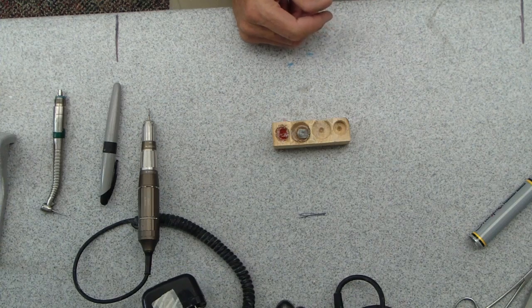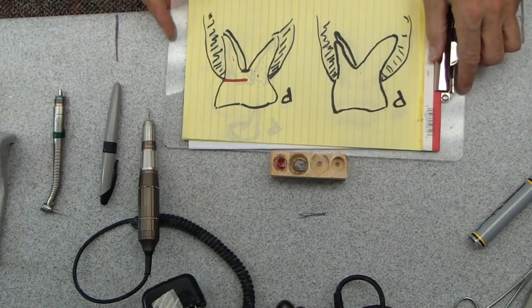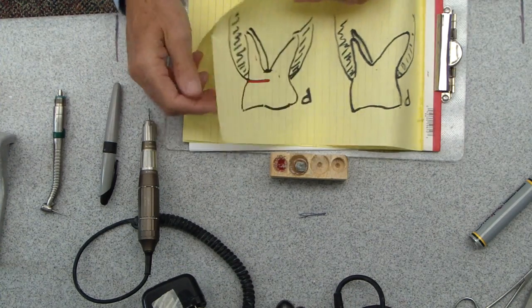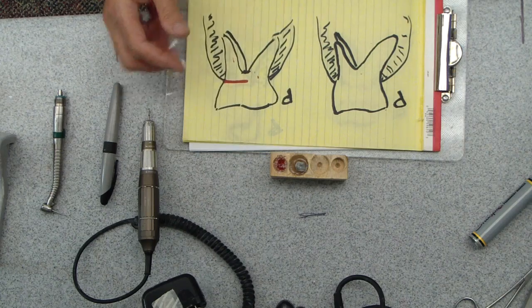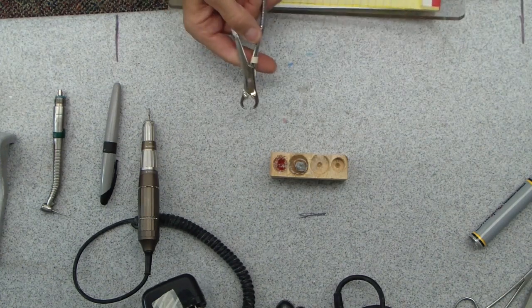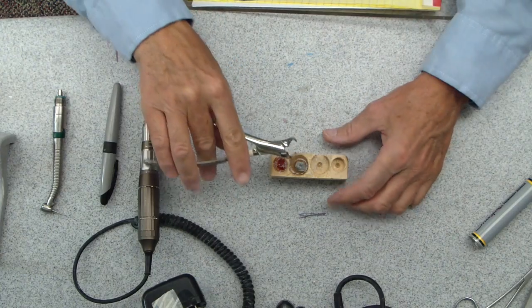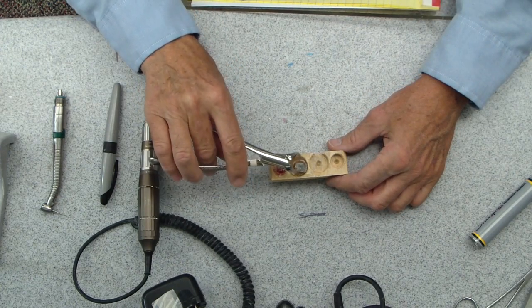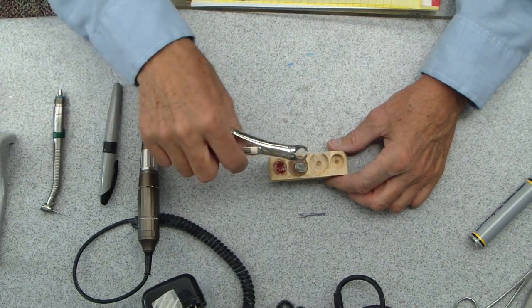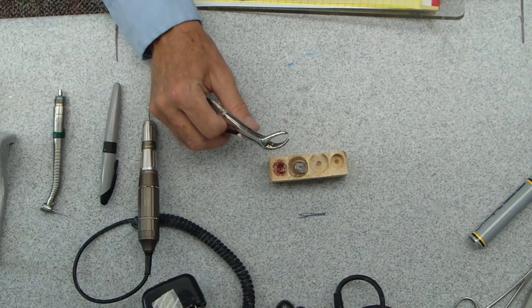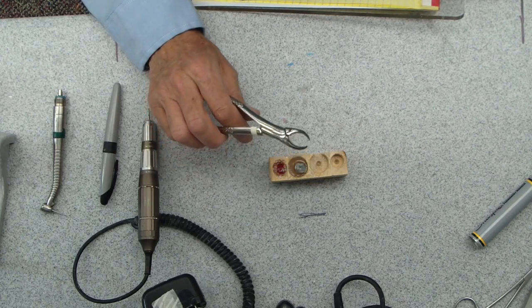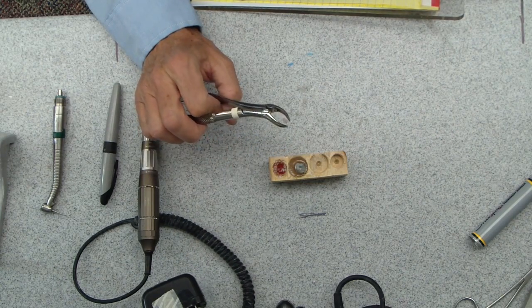Now I find with these teeth, what I like to do, I like the 23 which is what we traditionally call a cow horn because it looks like a set of cow horns. This will get down into the furca and get a good hold on the tooth and you can rotate it right, left, up and extract the tooth pretty easily with that if you get a good grip on it, and that's a big if.